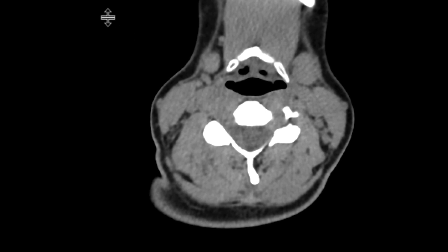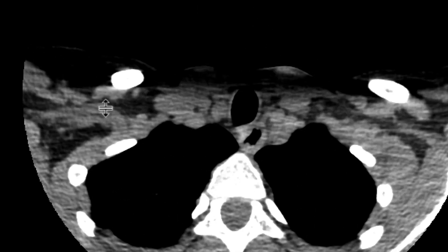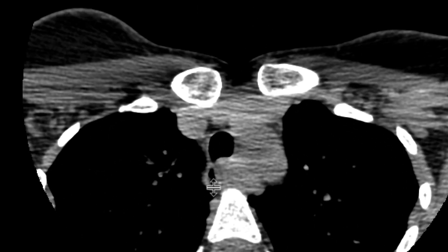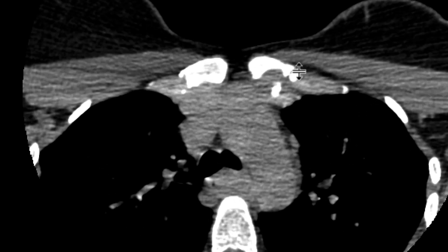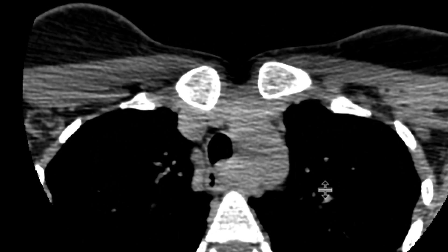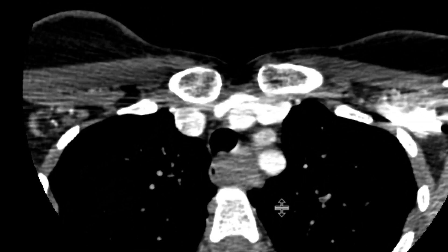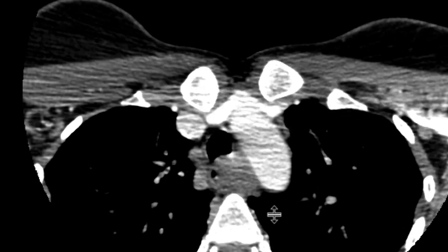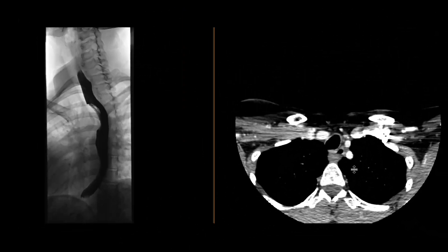A CT scan was obtained to further evaluate this. We can see on the CT scan here — this is the mass. That's the esophageal lumen being compressed by this mediastinal lesion, and it's low in density to start with. Contrast was given, and on the contrast phase there's actually no enhancement. You can take the pre- and post-Hounsfield units, and there's no enhancement associated with this.